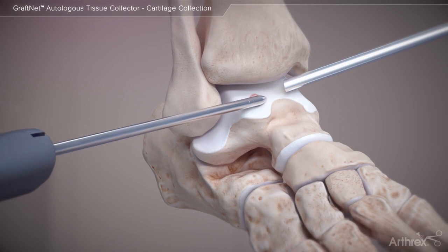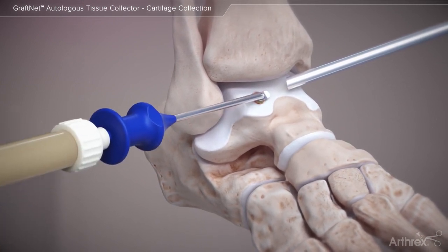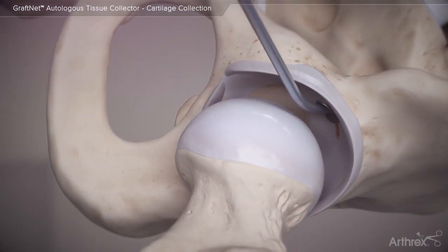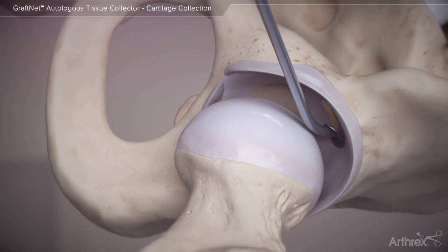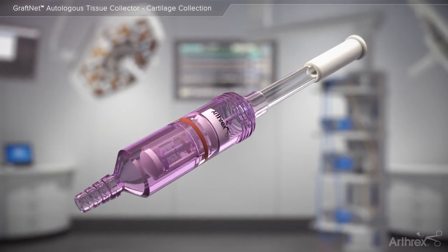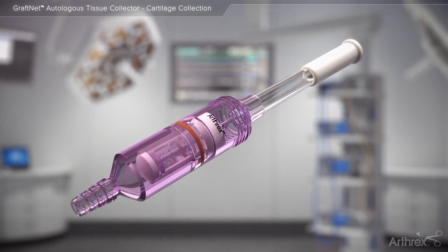The autologous tissue collected by GrafNet can also be used to repair chondral defects of the talus or acetabular cartilage defects in the hip. The GrafNet autologous tissue collector makes gaining access to autologous tissue as simple as resect and collect.